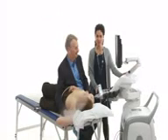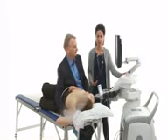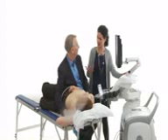But measuring gradients is only one side of the story. It's also important to know how to obtain a very good signal. And this we're going to show you right now. So our patient is 85 years old, has a suspicion of aortic stenosis, but we want to know the degree of the stenosis. So what are the next steps?